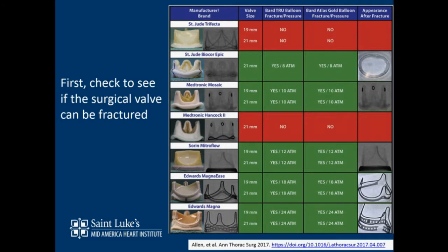There's also the issue of the difference between a CoreValve and a balloon expandable valve. It might be, we're not absolutely sure of this because we didn't use a fresh surgical valve. We didn't have any money for this, so we basically stole these valves. We got a couple of valves. We won't tell anybody. But yeah, we didn't use a fresh balloon, but we tried a fresh valve.